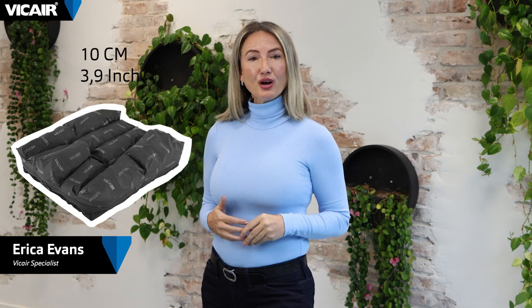In this video I will explain how to adjust for single side foot propulsion on the high model of the V-Care Vector O2, the 10 centimeter thickness.